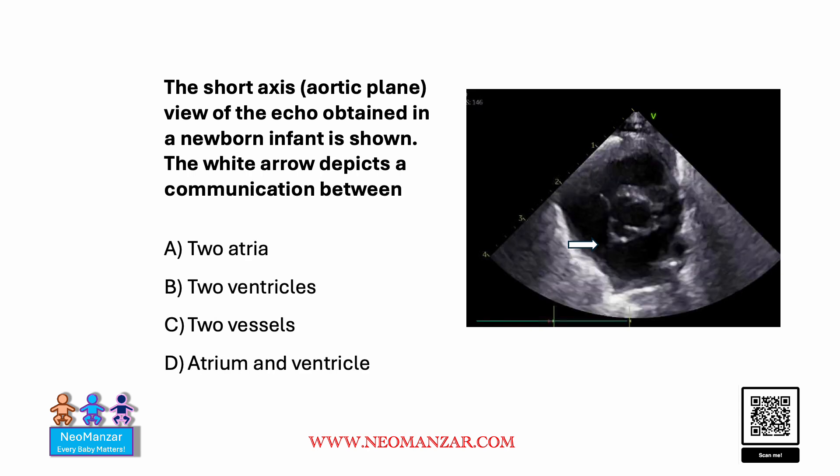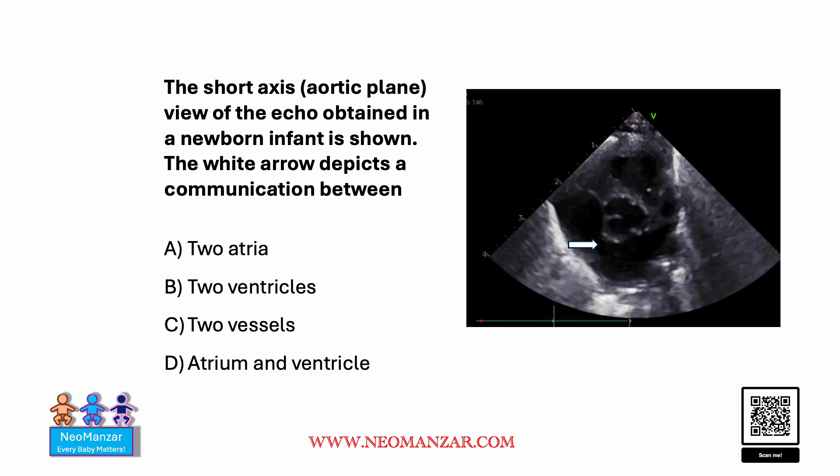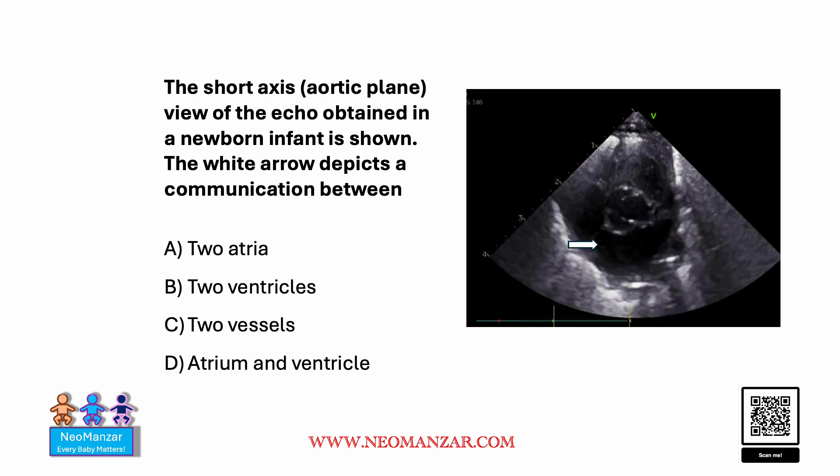Let's look at another version of the same question. Here the question is changed but uses the same echo. They are asking: the white arrow depicts a communication between two atria, two ventricles, two vessels, or atrium and ventricle?